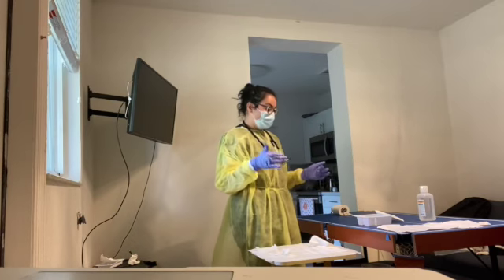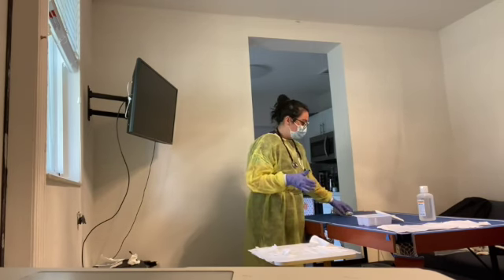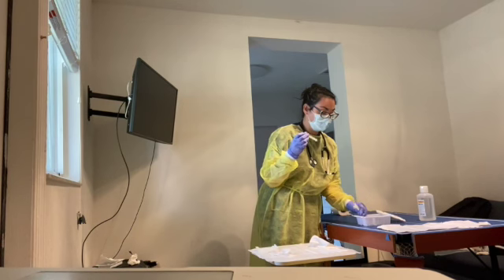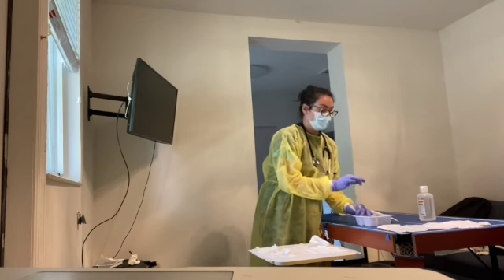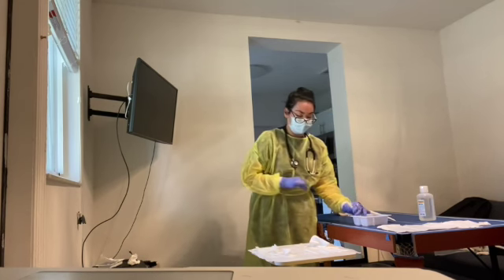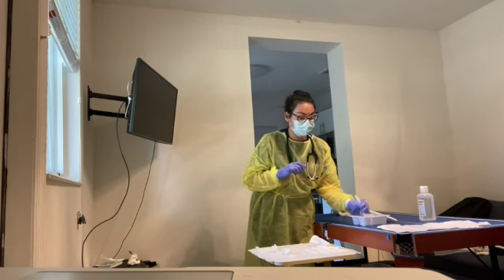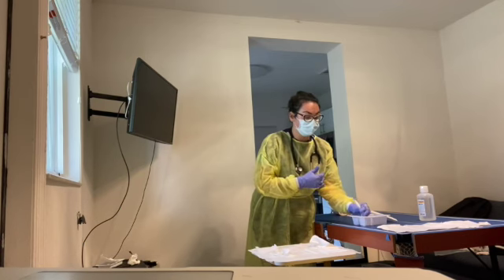At this time, I'm going to take my non-dominant hand and grab the patient's cannula. I'm going to take it over the basin. I'm going to grab my brush. I'm going to dip it in the first tray and brush, making sure that any drainage or anything that's occluding goes into the first tray. Then I'm going to not cross my sterile field, and I'm going to get rid of my brush, and I'm going to place the cannula into the second tray, making sure that it rinses out any possible debris that's still in the cannula.